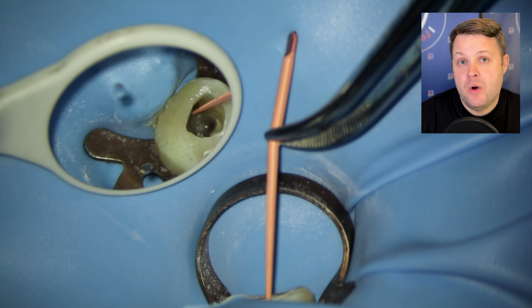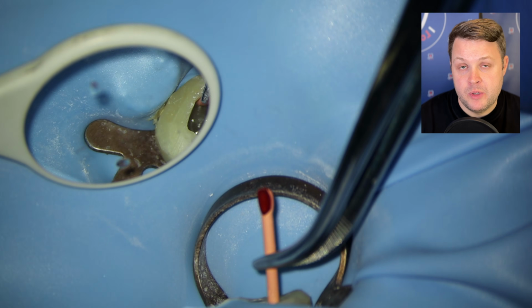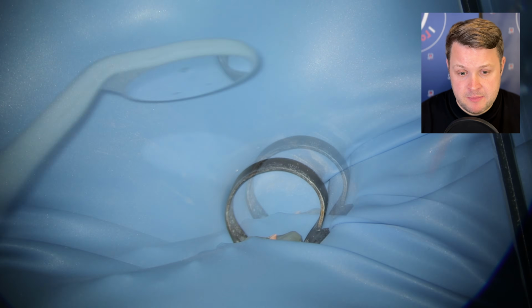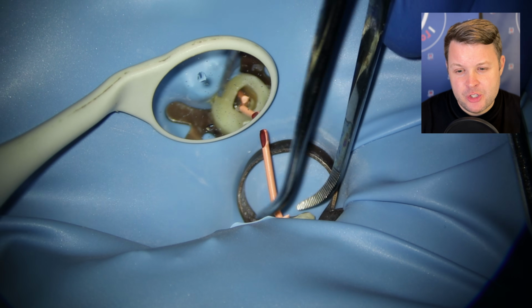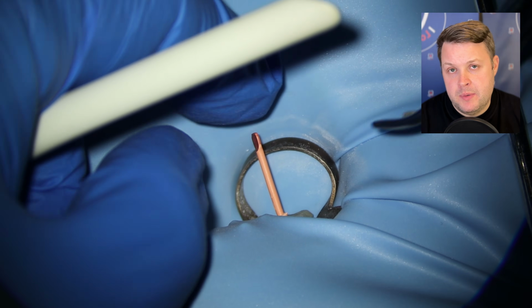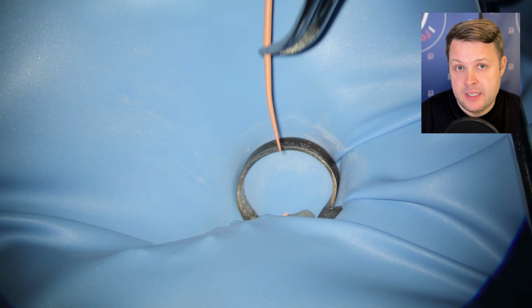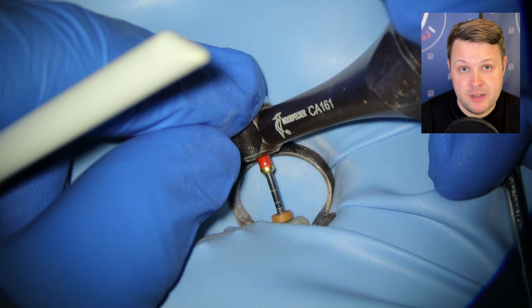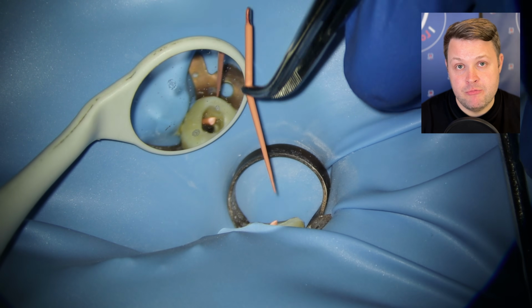And then we're ready to do our cone fit radiograph. We're going to check that all our cones are going to be at the correct length when we come to obturate the tooth. So I'm going to measure the cones and fit them to length, and what I notice here in the DB is that the DB cone just isn't quite going all the way. Again, the worst thing to do here is to go, oh, you'll be all right, we're near enough. But if you don't obturate a tooth correctly, you're going to leave space for bacteria to proliferate. And the only thing to do here is to pull the GP cone out, re-irrigate, reshape.